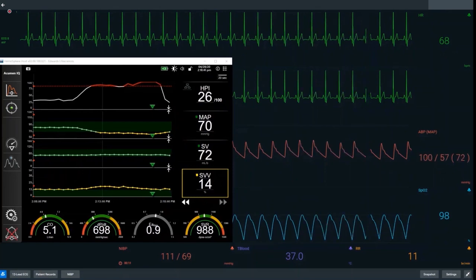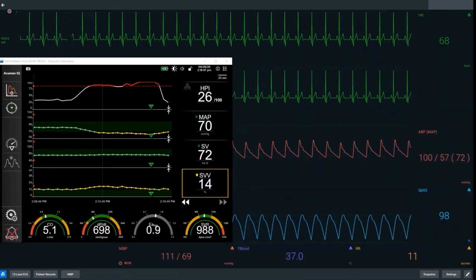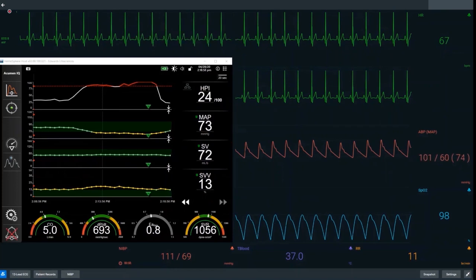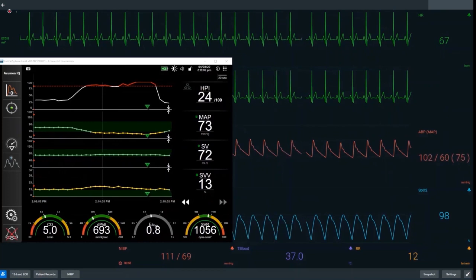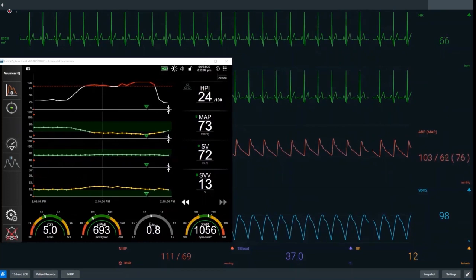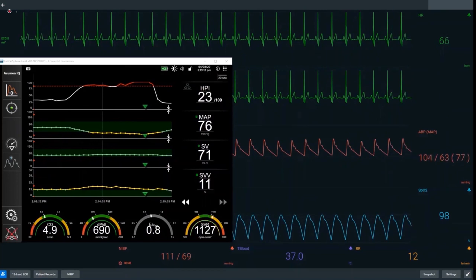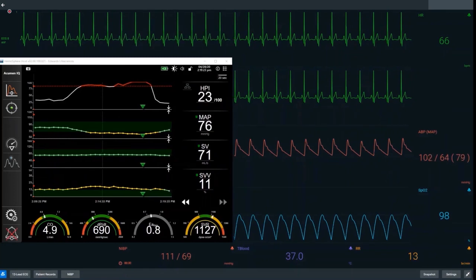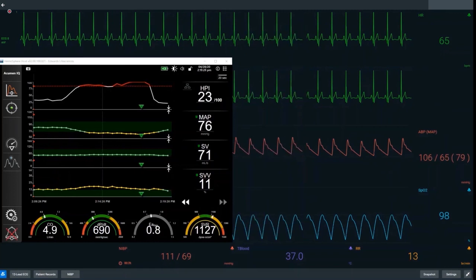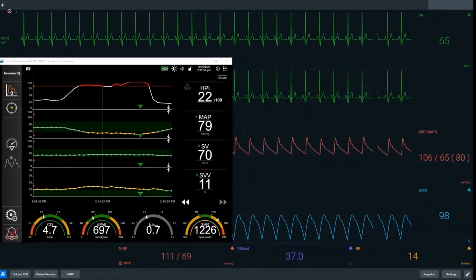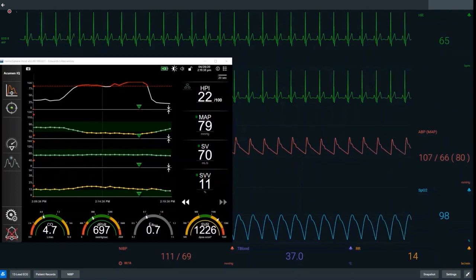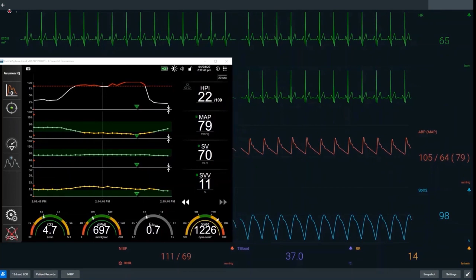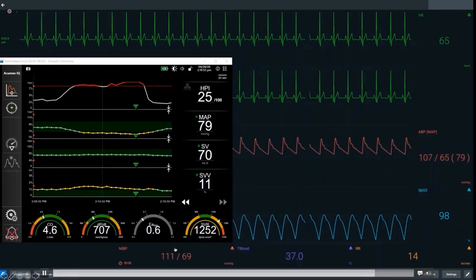It's important to notice that giving a vasopressor has not changed EADYN, because EADYN is not a measure of systemic vascular resistance. Afterload is part of a function that goes into EADYN, but it is not a number that tracks with vasopressors. Approximately one minute post vasopressor, HPI is down to 24 — a significant drop. MAP has increased to 76, stroke volume has dropped very slightly as expected, SVV has normalised to below 12%, and SVR has increased from around 800 back to normalised values of approximately 1200.